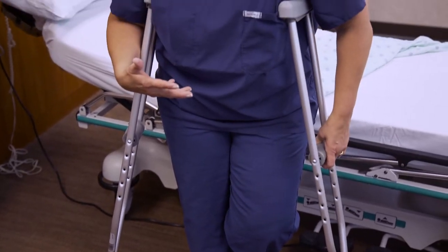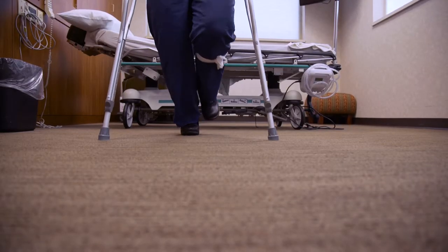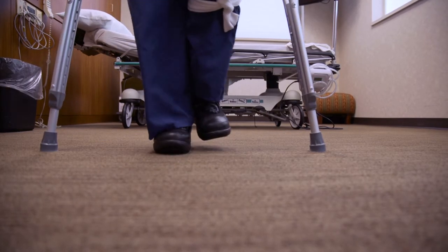Now it's time to walk. Take your time and be deliberate. Stand upright — don't lean forward. Be sure to place the crutches far enough apart to provide generous room for your legs to swing through.